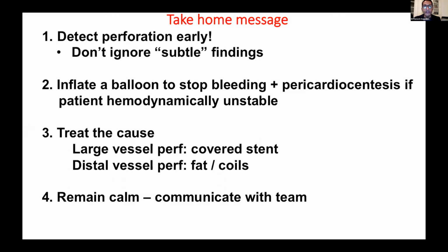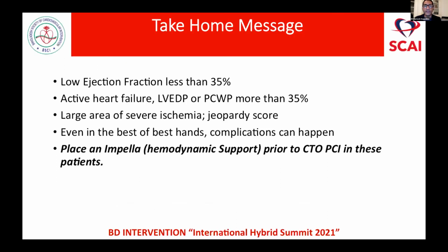Treat the cause: large vessel perforations, covered stent. Distal vessel perforation, fat or coil embolization. Number 4 is most important: remain calm. Communicate with the team. Everyone in your team should know what is happening.